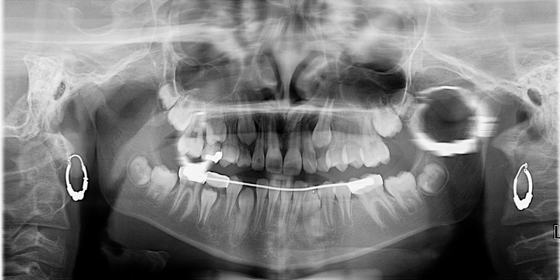Mandibular canines are erupting nicely. It looks like number 29 is slightly delayed in its eruption relative to the contralateral side. Number 20 is fully erupted, while 29 is still in the process of erupting. Interestingly, if you look at the maxilla, we're seeing the same pattern.